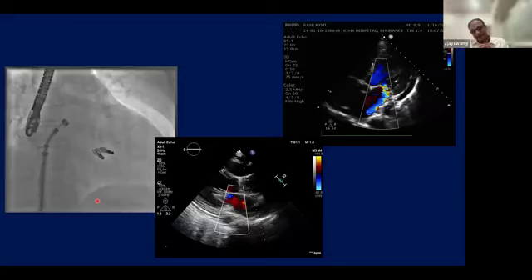Several years back, there was a concept that after you do PCI in acute MI, if the LV is 20-30, you take a catheter through the IVC and just drop an AICD inside, just like we are doing with leadless pacemakers. Everybody said in Europe, oh, very exciting. We'll be able to do it in 5 minutes.